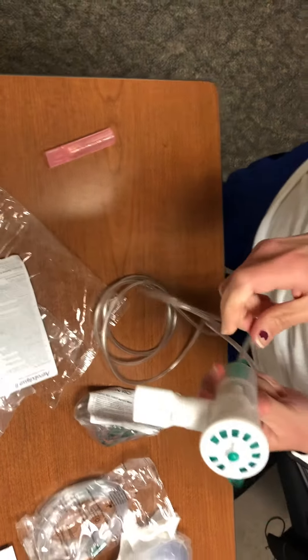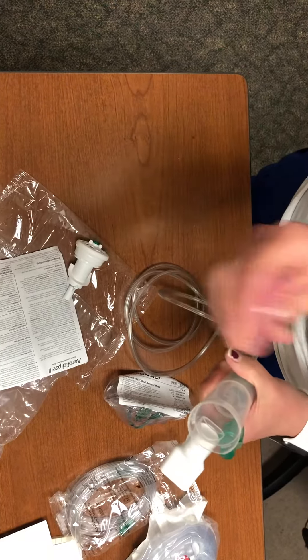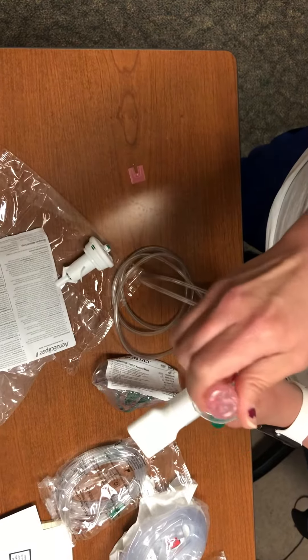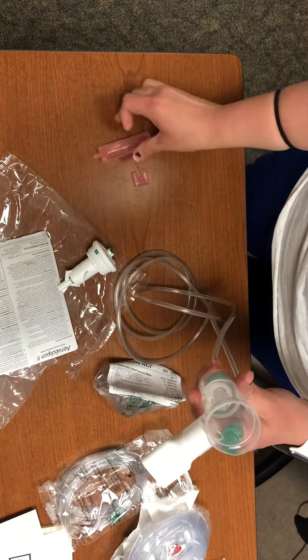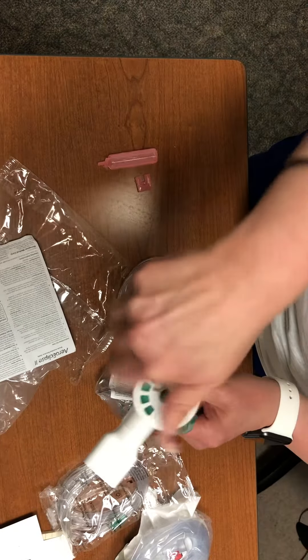So flow meter connected. Then you're going to open the top — it just turns and twists off. We're going to pretend this is your albuterol or your duoneb. You're going to squirt that down into the cup, then put the piece back on top and twist until it locks.